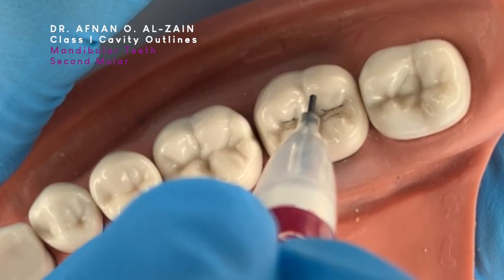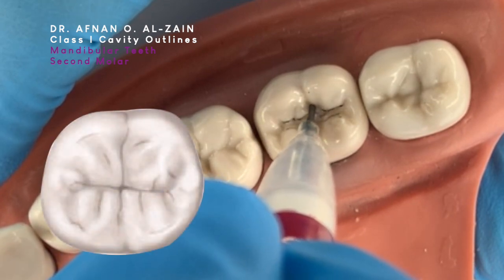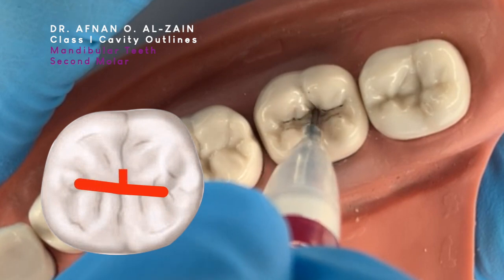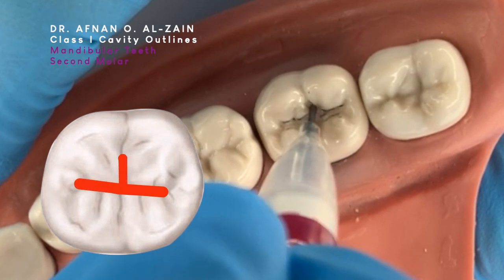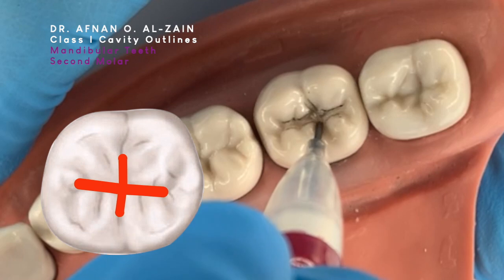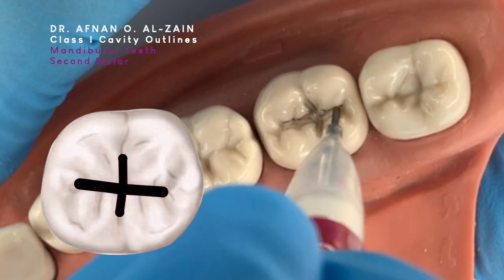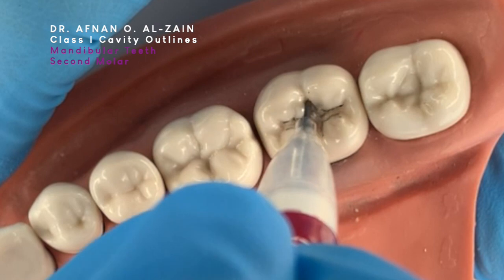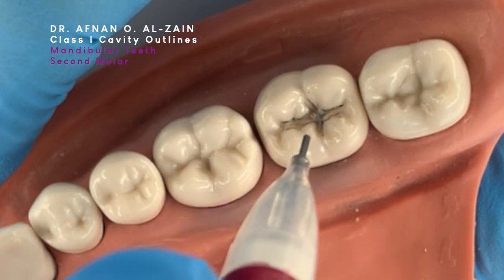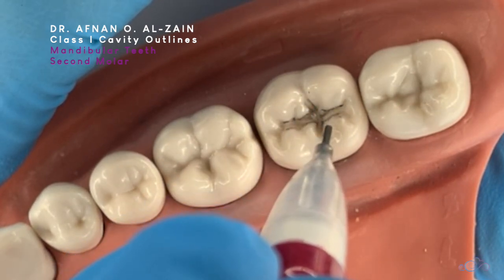Then we're going to extend buccally and lingually. We're going to go halfway from the center of the central groove — extend buccally, and then lingually the same thing. From the center of the central groove, we're going to extend. So we're going to have a cross shape. The outline in tooth number seven is cross-shaped.